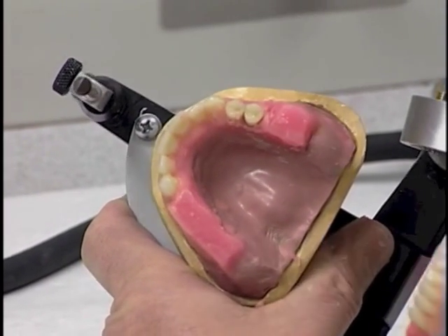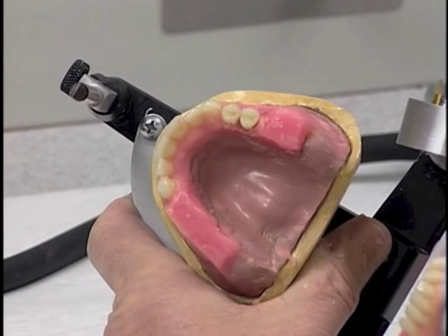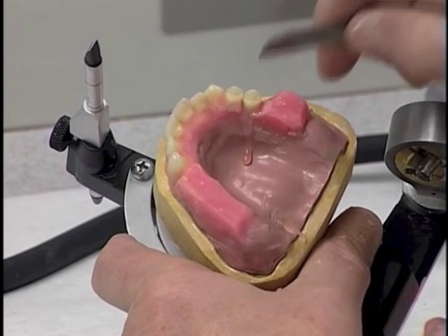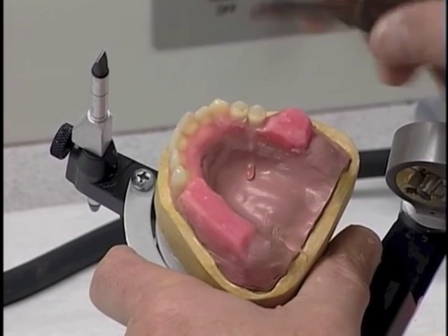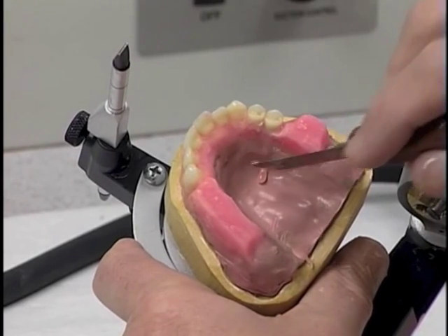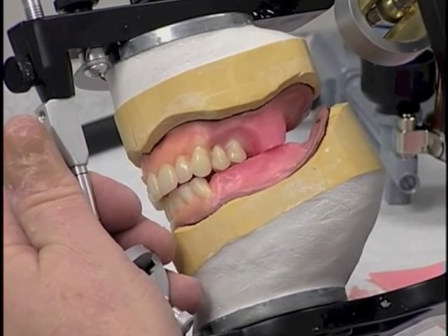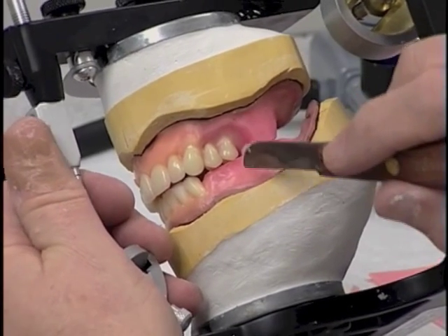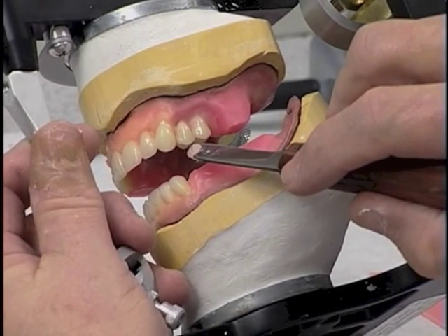So let's stabilize it by just flowing some wax around it, melting the wax that's around it and letting it flow up against the tooth real well. And now that we have that stabilized, we're going to make sure we have no wax left on the occlusal surface of those two posterior teeth, because that's what's going to determine the position of a lower second premolar. Now what we want to do is arrange a mandibular second premolar so that the buccal cusp tip of that mandibular second premolar fits right into the fossa formed by these two teeth right there.